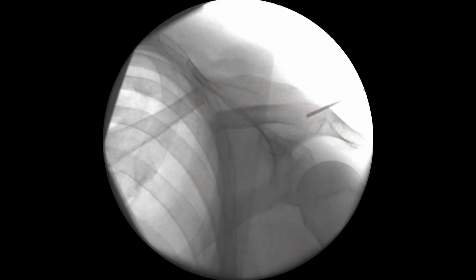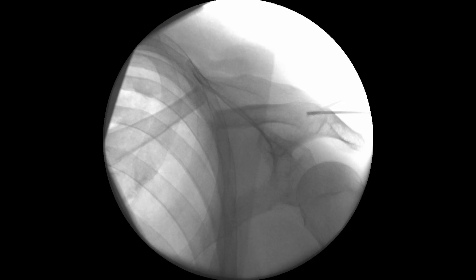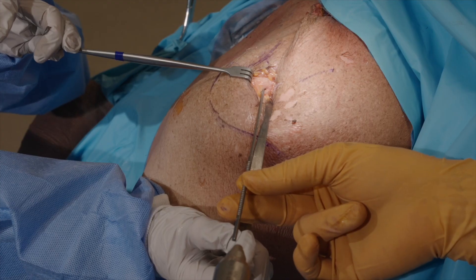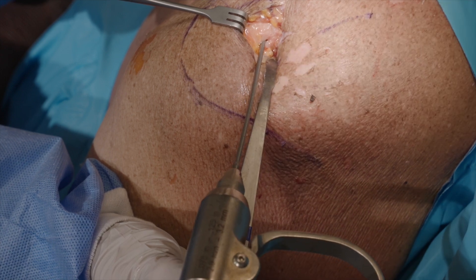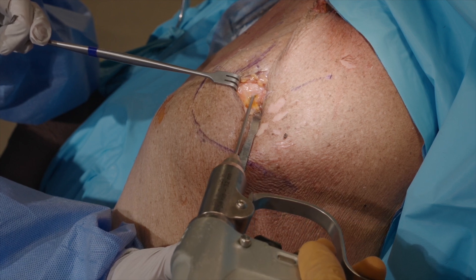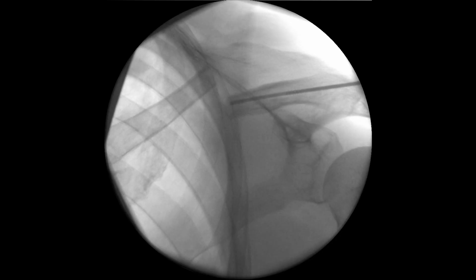Check the position and direction of the Anser clavicle pin inside the lateral fracture element by means of fluoroscopy in two directions. By hand, adjust the direction of the Anser clavicle pin based on the fluoroscopy images so it is aimed down the canal, and check again. Place the universal pin driver on the 2.6 millimeter part of the pin closest to the 2.2 millimeter part. It is necessary to apply gentle collinear pressure to advance the Anser clavicle pin. In some cases the canal is narrow and more pressure is needed. Make sure the direction is appropriate; otherwise the chance of creating a false route exists.